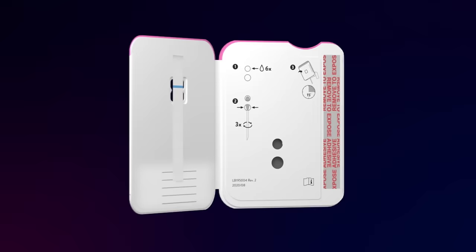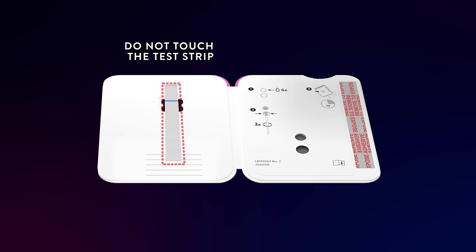Open the test card so it lies flat on your table. Do not touch the test strip.